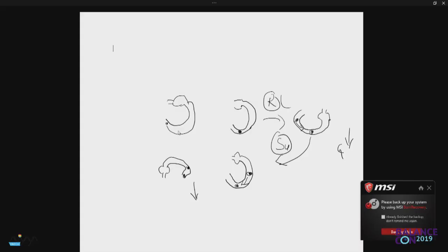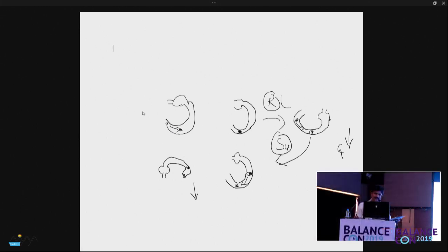Now the same person, from that he comes back to the supine position. You see this? He goes back to the supine position. It was here, then the debris comes here, which means again the movement direction is like this, which means the eye goes in this direction. Correct? Then you are supposed to expect a right beating. Are you getting a right beating nystagmus?